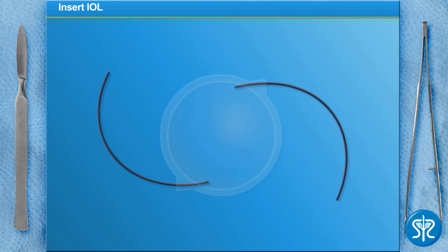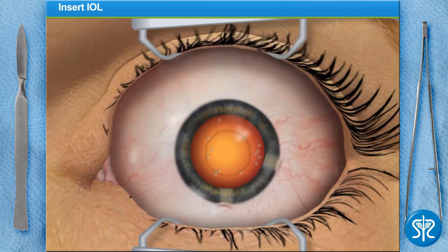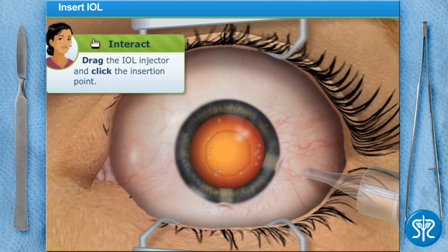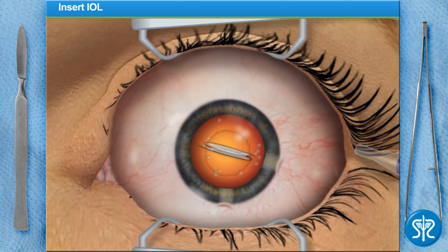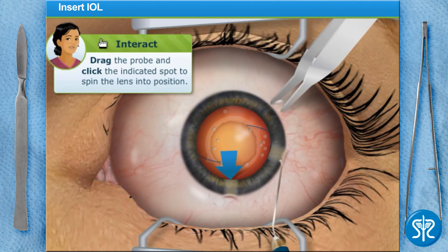The flexible intraocular lens is rolled up for insertion by the assistant and placed in a soft tube. The IOL is now injected through a tube into the vacant lens capsule. A probe is used to spin the lens into place.